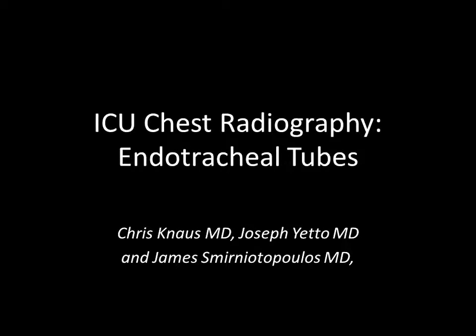Hello, this is a brief lecture on ET tubes and their presentation in ICU chest films.